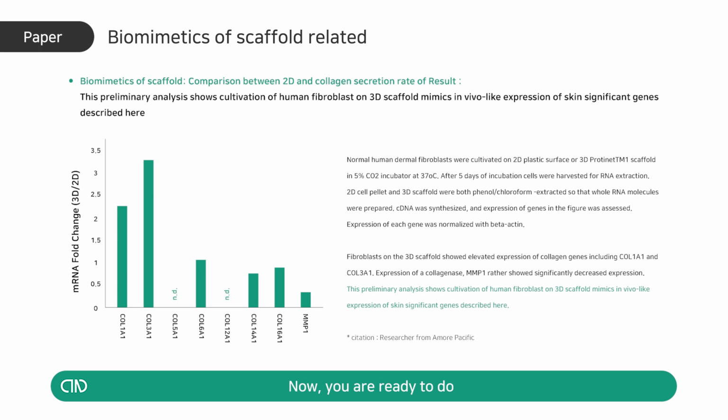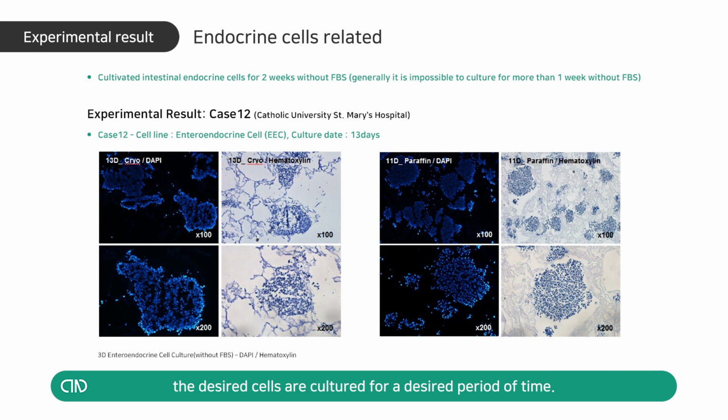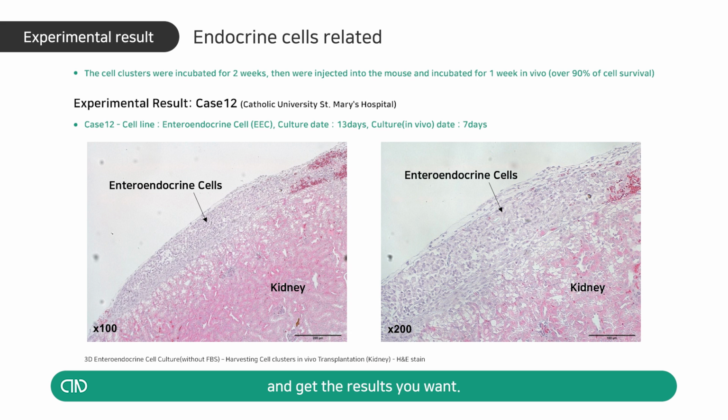Now you are ready to do all the experiments you used to perform on actual tissue. Using all the used reagents, tools, and equipment, the desired cells are cultured for a desired period of time. So you can create the desired size and shape of the organoids and get the results you want.